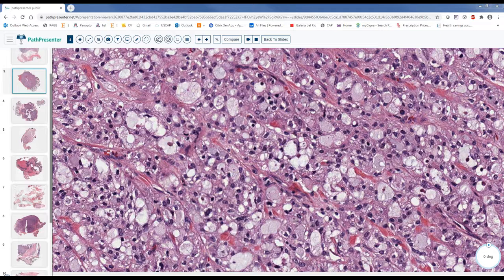Actually they found that secretory carcinomas are more common in salivary gland than breast. So some people say in the breast they would like to call it salivary gland analog secretory carcinoma. It's like reversing the magic, but it is just crazy things that people do. Pathologists are crazy sometimes. So this is what they call secretory carcinoma.